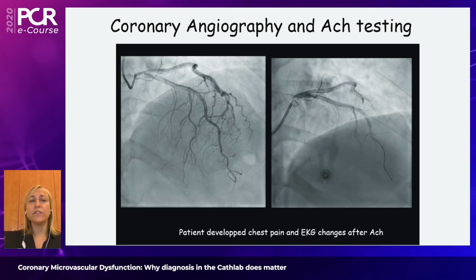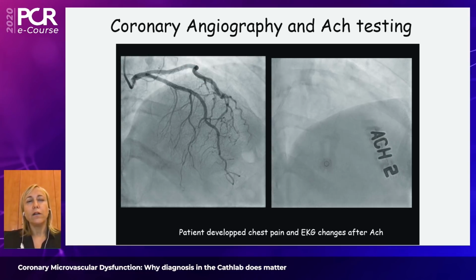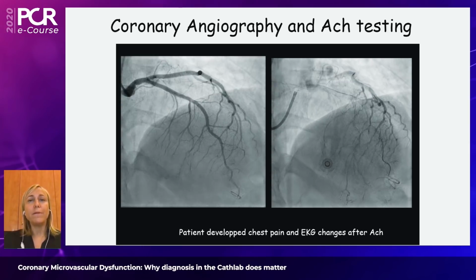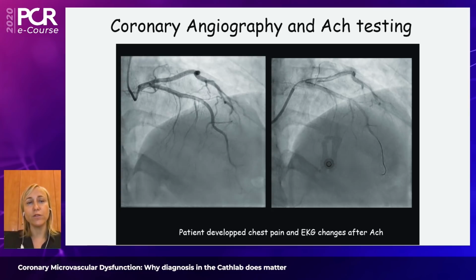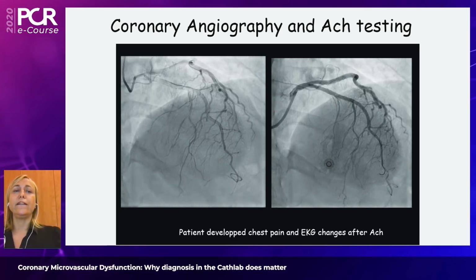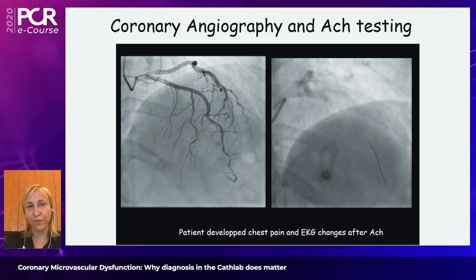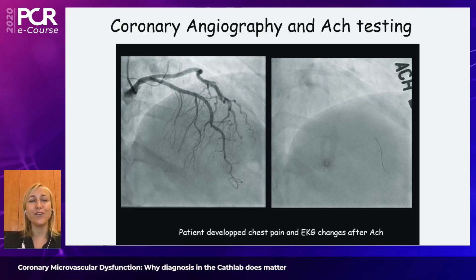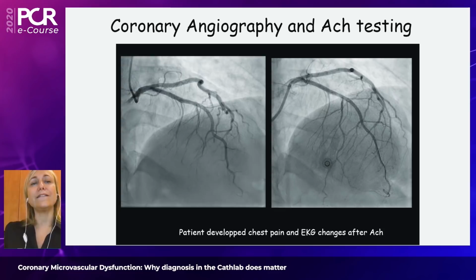In this case, we didn't stop here because we can discuss CFR value if it was abnormal. It is most probably, but in order, because in my lab I have it available, and because I have also to say in our hospital as a full professor since last year was Professor Camici, that was one of the pioneers of this kind of disease, and we learn a lot also from his studies.